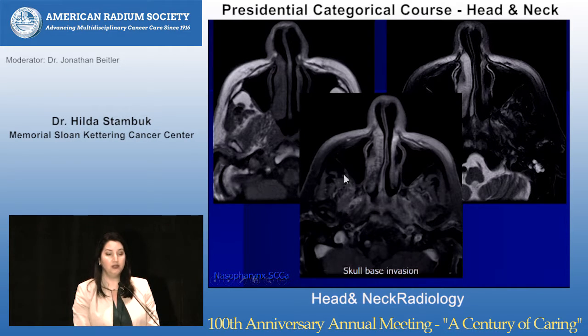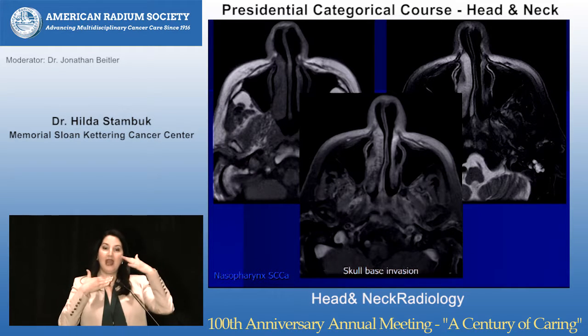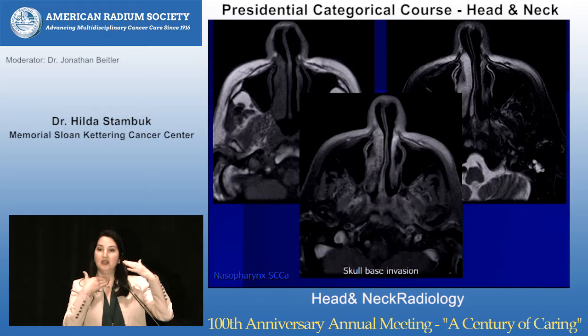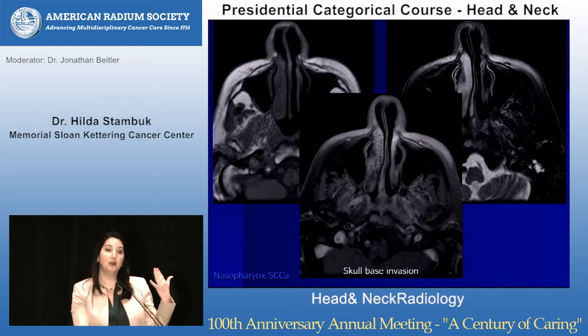You can do a post-contrast fat-SAT image, and what does that do? Well, the fatty marrow that we saw originally suppresses, and you can see the enhancing tumor. So you're thinking, why don't I just use this sequence? Well, because the head has such a variable shape, and it's a different size and shape than the neck, and the neck than the chest, you can see that we can have distortions and you can get incomplete suppression of fat. And why am I telling you this?